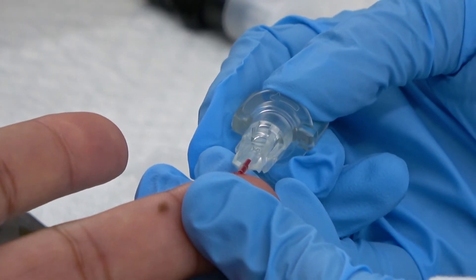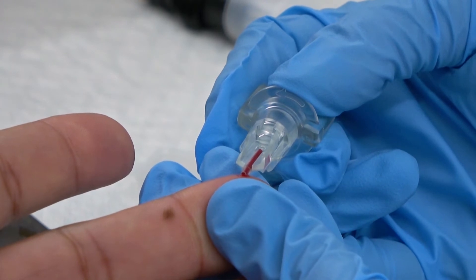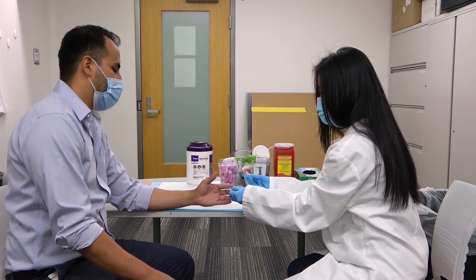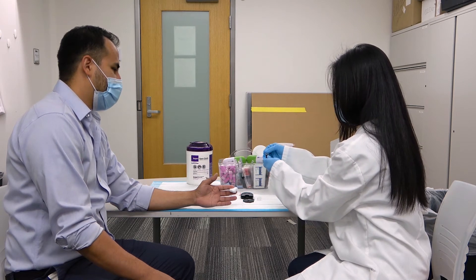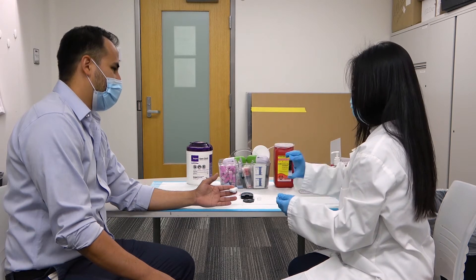Collect the sample in the provided capillary tube, ensuring the capillary tube fills with patient sample. Provide the patient with a cotton ball. Combine the capillary tube with the sample dilution kit and mix 6 to 8 times.